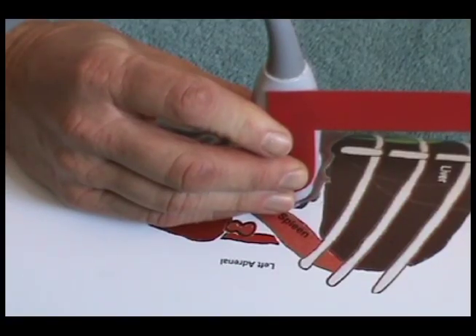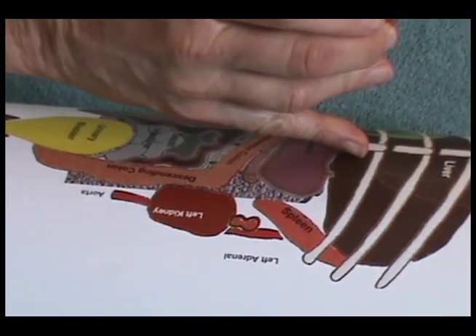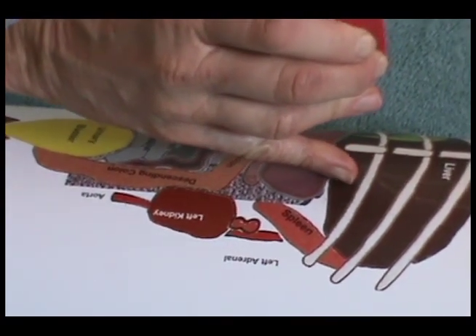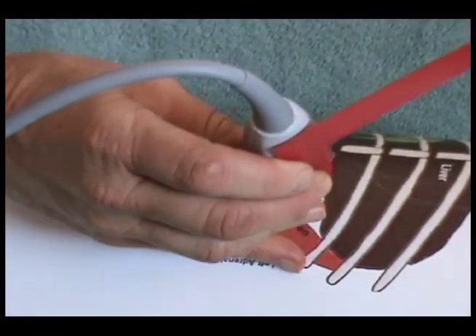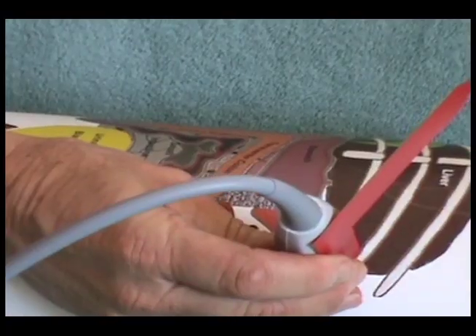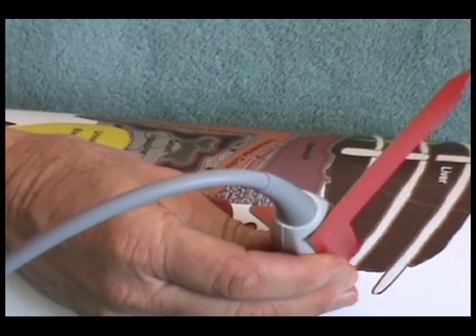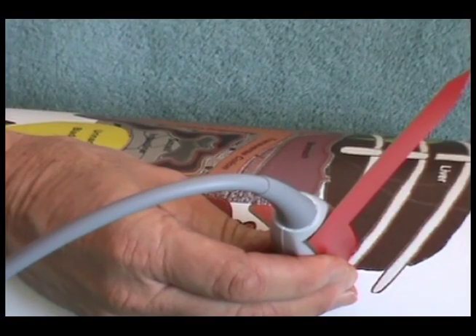Use the little finger of the transducer hand to feel for the last rib on the patient's left lateral side. Place the transducer in an off-sagittal position on the left lateral side and cranial to the last rib. The transducer is off-sagittal to look between the ribs.